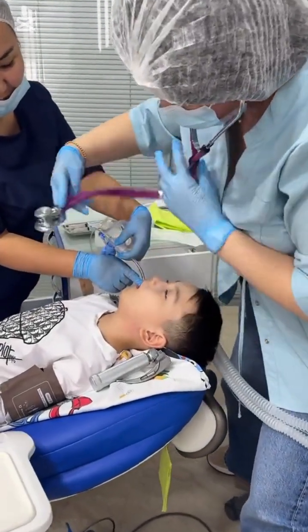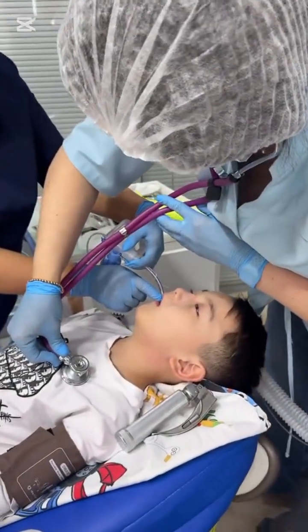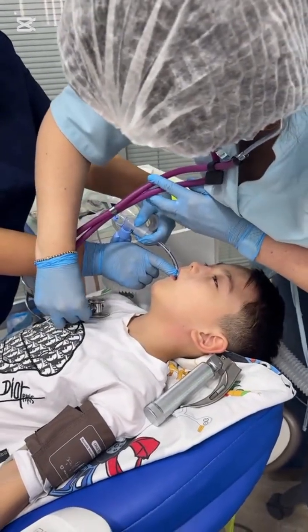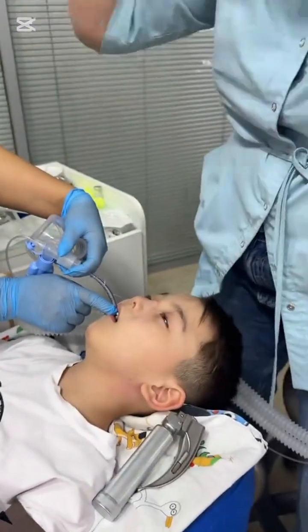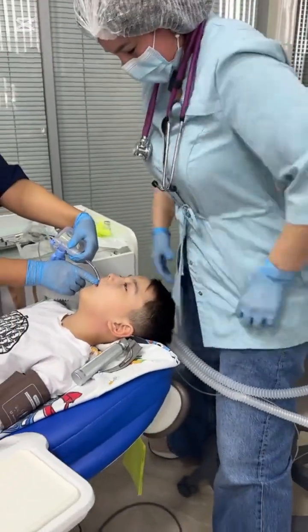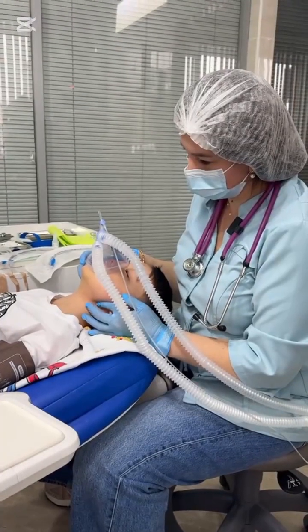Lastly, during airway assessment or in some intubation techniques, you may observe pressure being applied with two fingers around the neck area, especially in patients with a short neck. What is this technique called and why is it important in ensuring a successful and safe intubation?